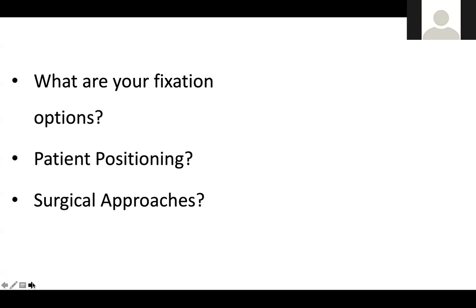what I've come across is that in these proximal femoral fractures, for a patient with good bone stock, we can use the conventional nail locking into the lesser trochanter. But for a patient with poor bone stock and a subtrochanteric fracture, we need to lock into the neck to get a good proximal interlock and also to reduce the risk of a neck of femur fracture.